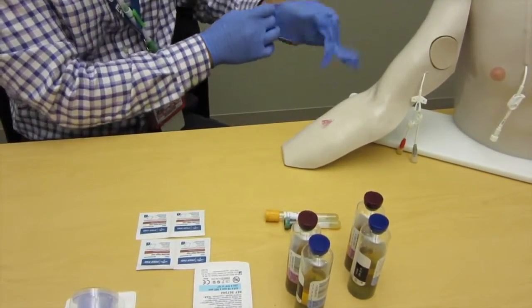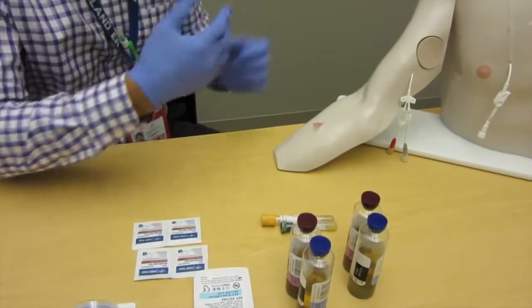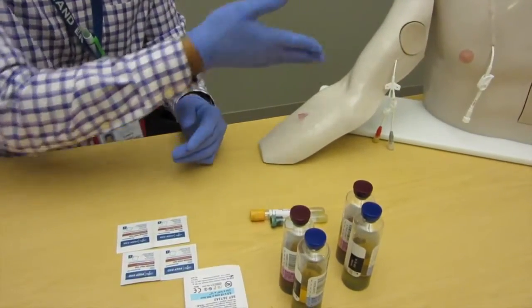30 seconds scrub, 30 seconds dry. Do not use your gloved finger, because most of the time when these cultures come back, they come back positive for staph epidermidis—something that's just skin cells that you introduced by using improper technique.